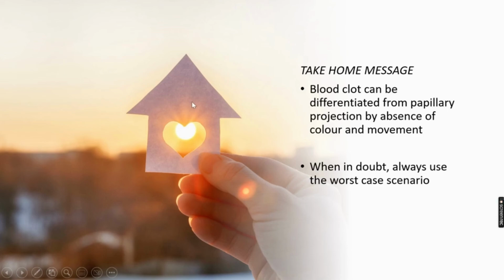So our take-home message is that blood clot can be differentiated from papillary projections because blood clot will not take up color and blood clot will move on probe pressure. When there is doubt as to whether one is dealing with a blood clot or a papillary projection, the worst case scenario should be used. Thank you very much.